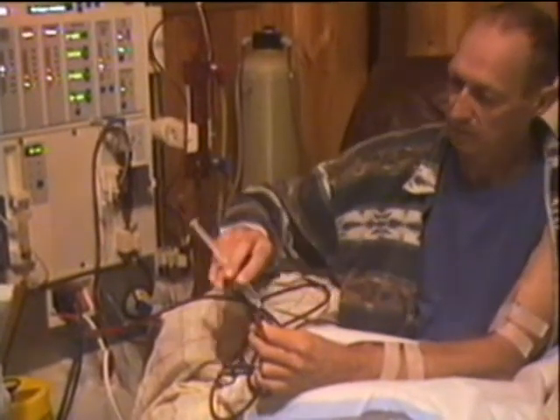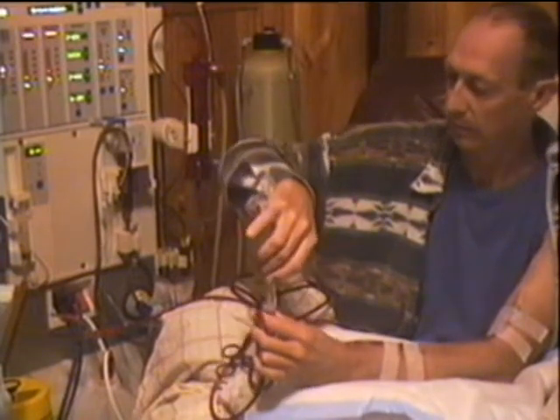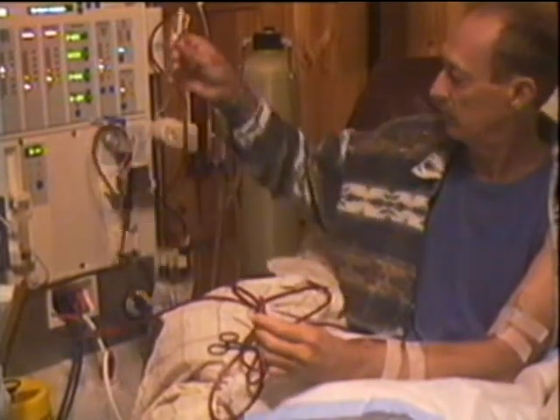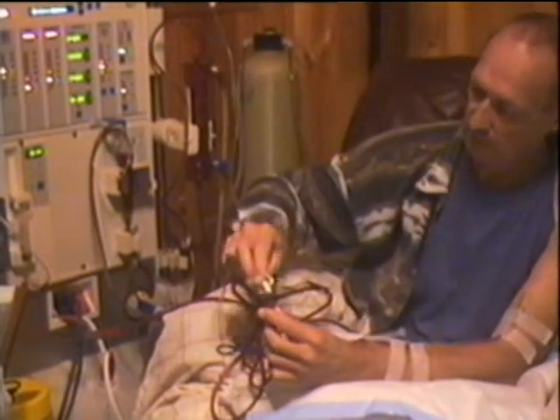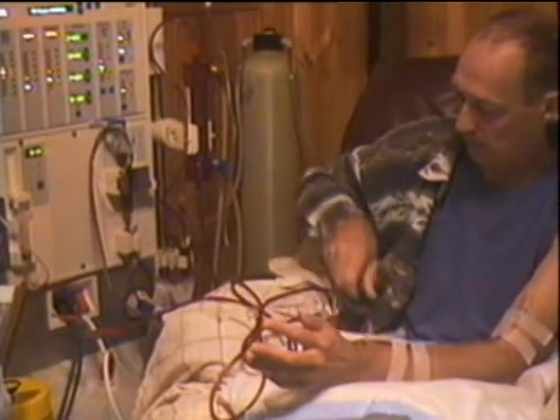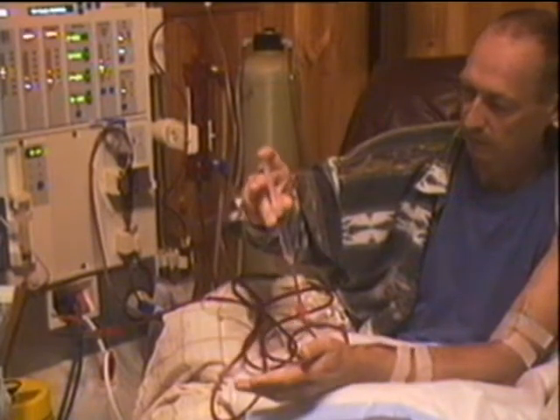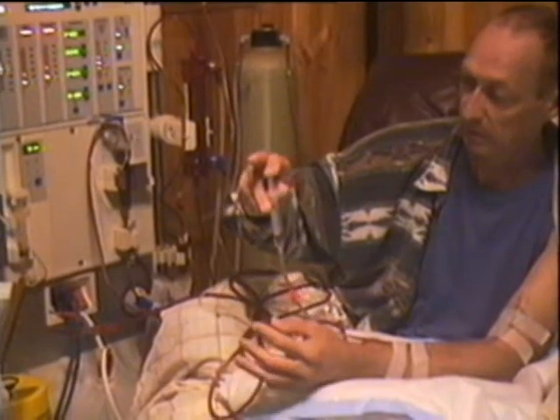This syringe, which I put saline in before, gets used here — put that down. And the saline line, which comes straight from the saline bag, will be connected to the arterial line, so I'm going to flush the blood back. That just pushes my blood back — every bit of blood is needed back.